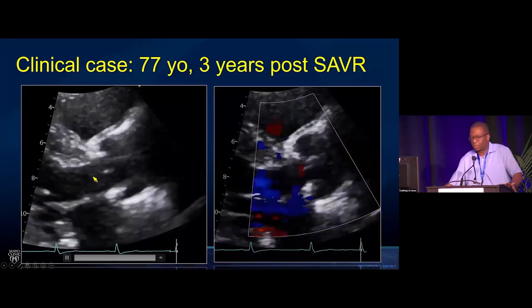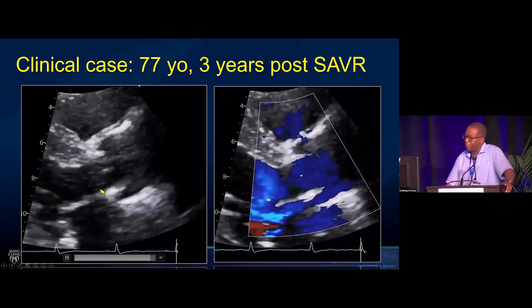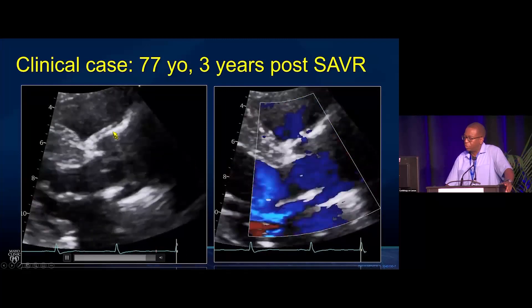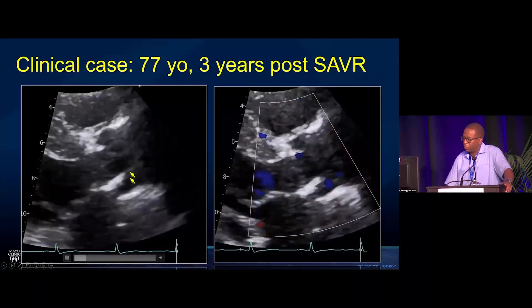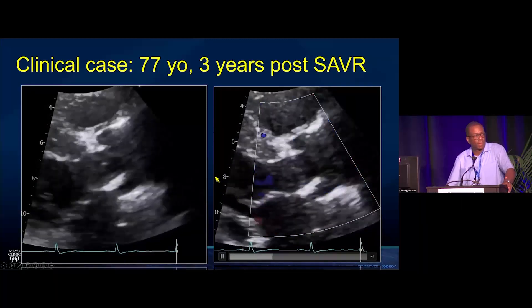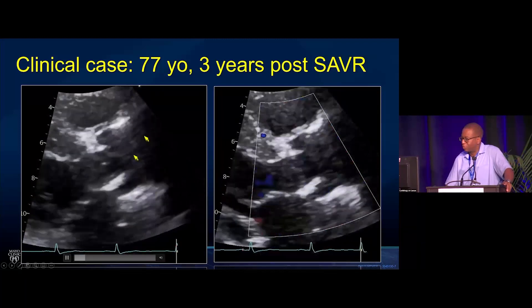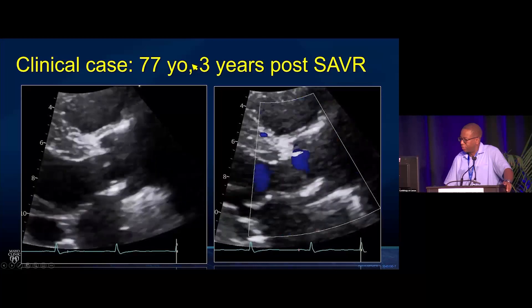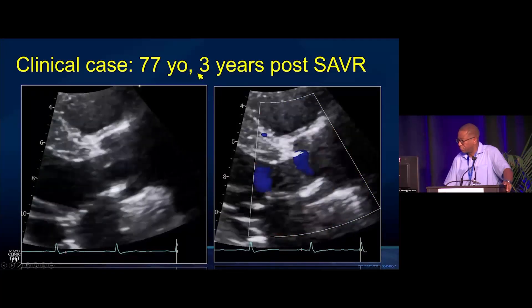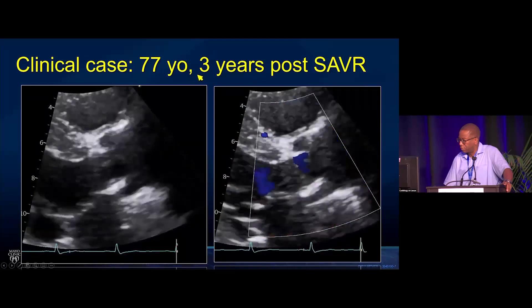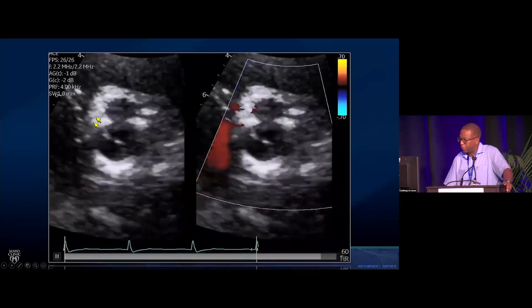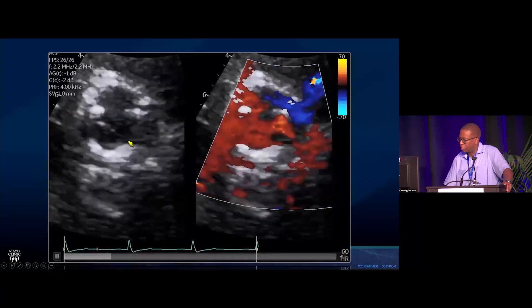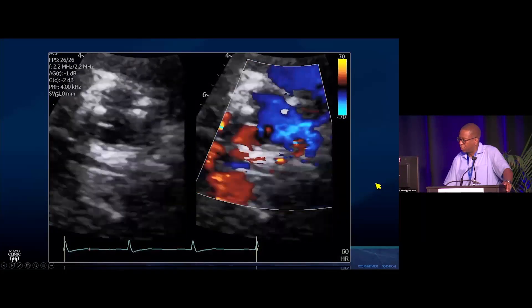The background is blue because the echo images show up better. This is a color-compared view, a zoomed-up view of the parasternal long axis of the aortic valve prosthesis. You can see the aortic valve prosthesis in 2D and then color across the aortic valve. This is the short axis of the valve, a zoomed-up view of the aortic valve prosthesis — you can see the struts — and then color flow across the aortic valve.